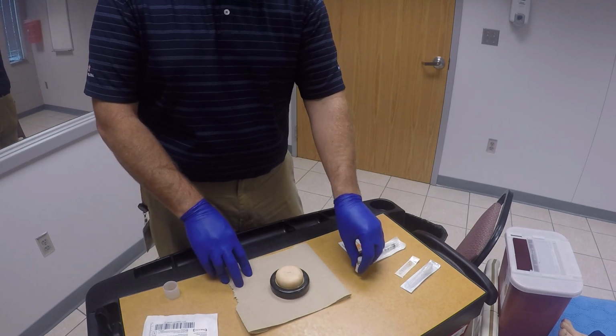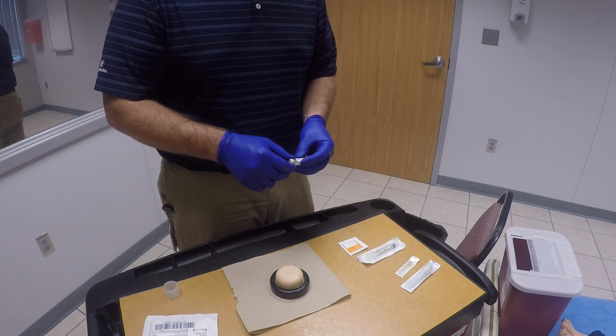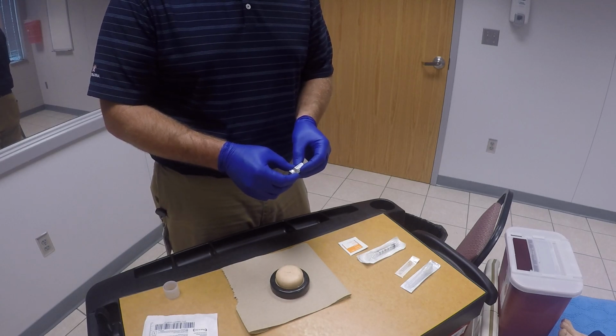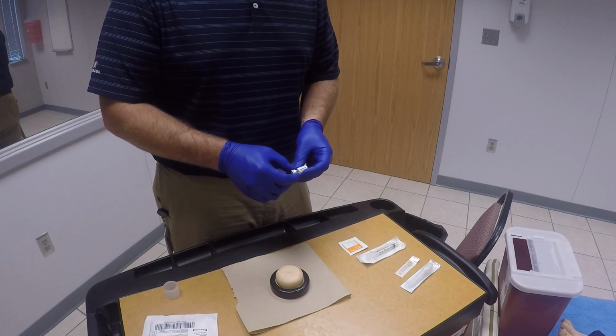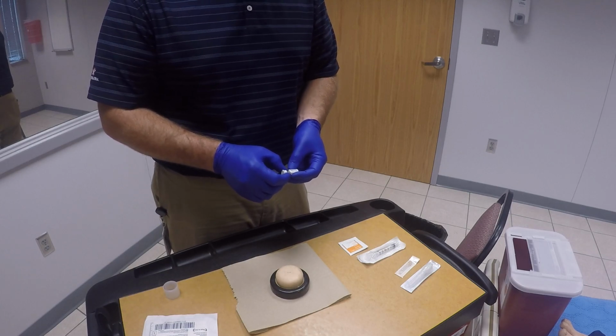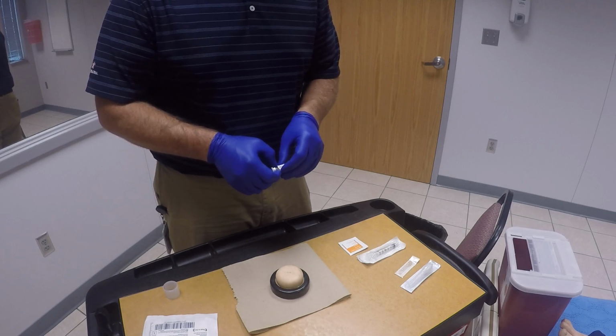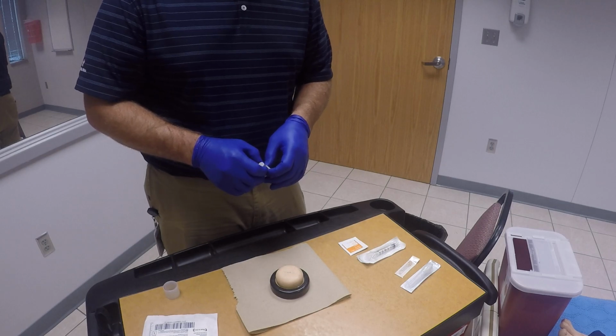First thing we want to do is take our medication and check our 5 rights. Make sure it's the right patient for the medication. It is the right medication that we're desiring to give. It is the correct dose and concentration, and today we're going to be giving 1/2 milliliter of this. And then it is the right time to give it to the patient, and it is the right route, so we're going to be giving it intramuscular.